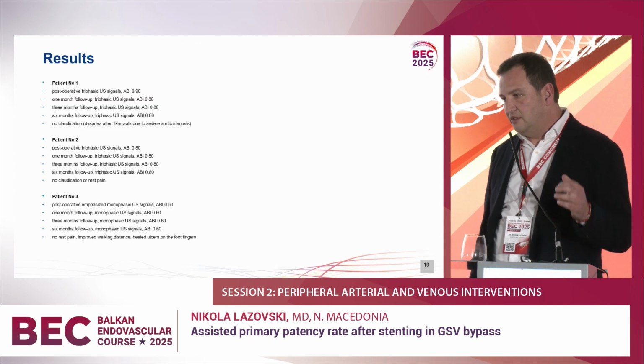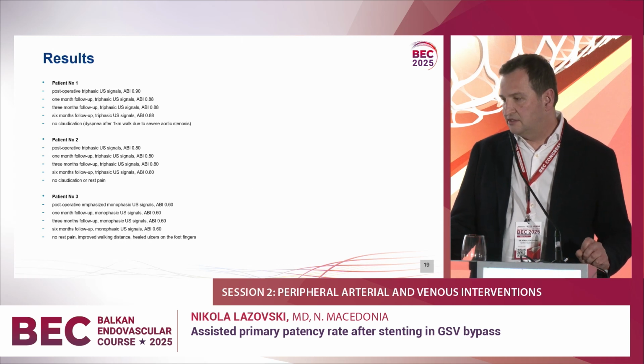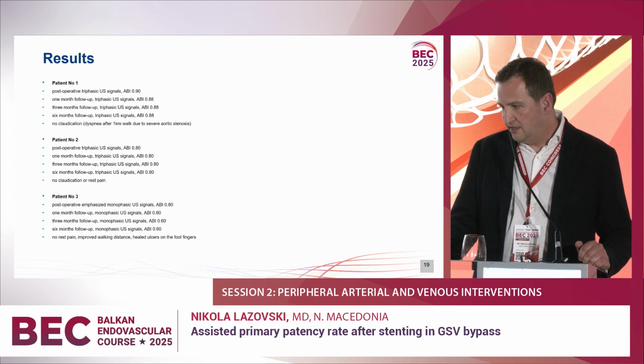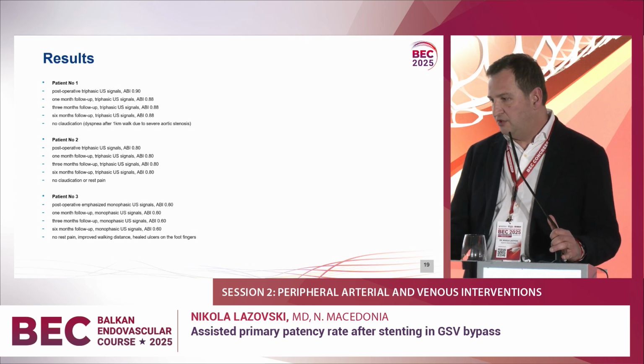After this, all three patients were followed up at 1 month, 3 months, and 6 months. They have excellent clinical improvement, and improvement of ABI indexes, which was stable during all the time of the follow-up.